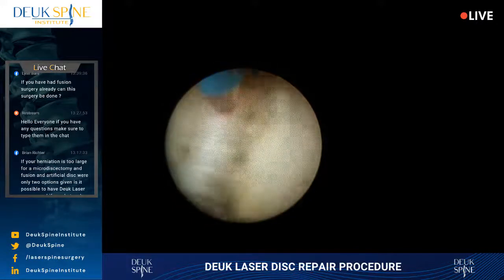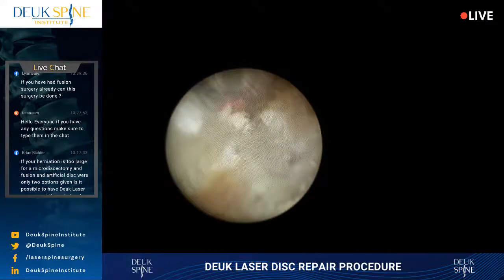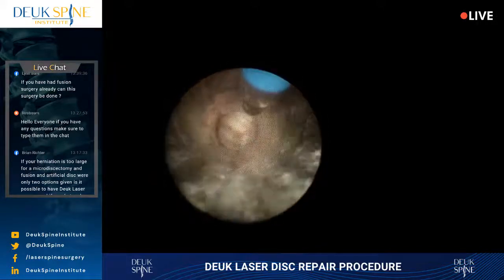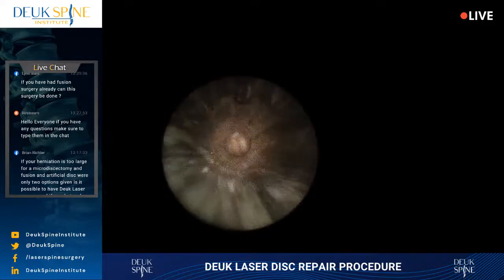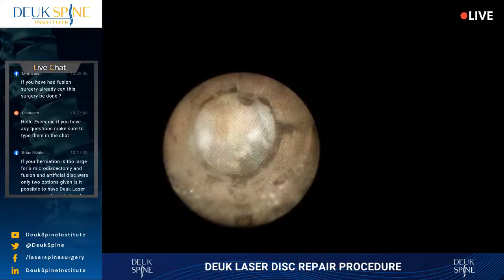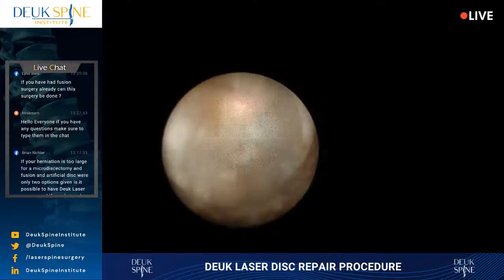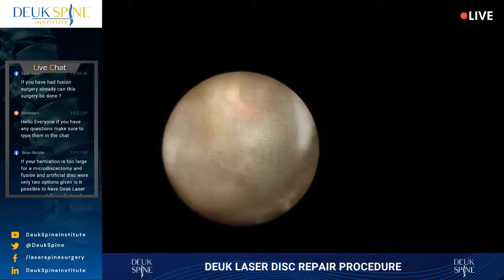All right, so that's the posterior longitudinal ligament fibers right there, and I have to inspect that area a little bit more. I don't want to leave any herniation behind. So I feel like I've gotten a lot of the herniation, but I want to check through that little crack there. But I'm not ready to do that yet. I need to clear away a little more of this stuff on the top.